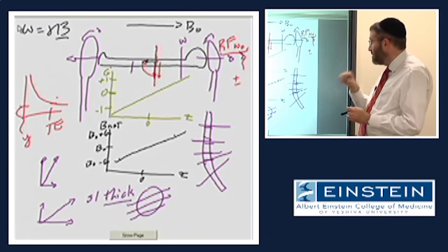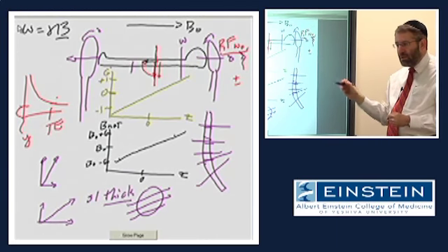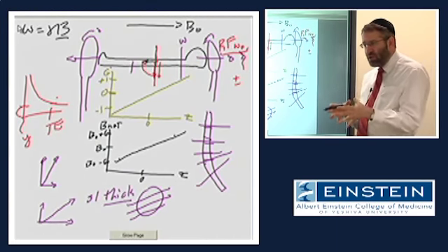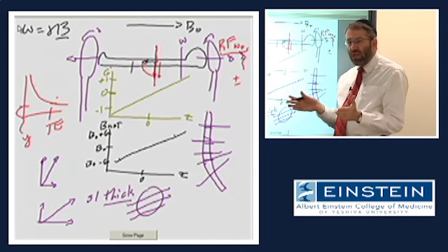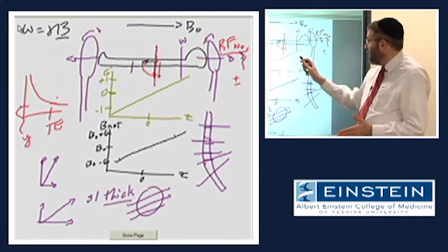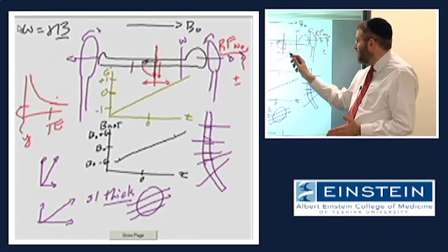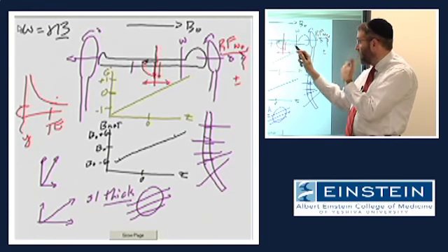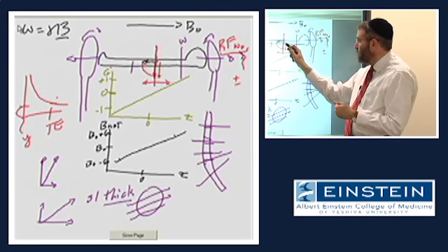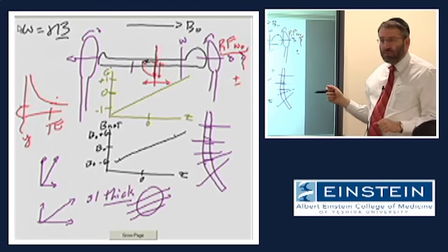And in fact, that range of frequencies is a parameter that we can modify. So the amplifier that generates this RF pulse actually generates some range of frequencies. The greater the range of frequencies that we transmit, the greater the extent of tissue at which we will find spins precessing at frequencies which match the range of frequencies transmitted by that RF.